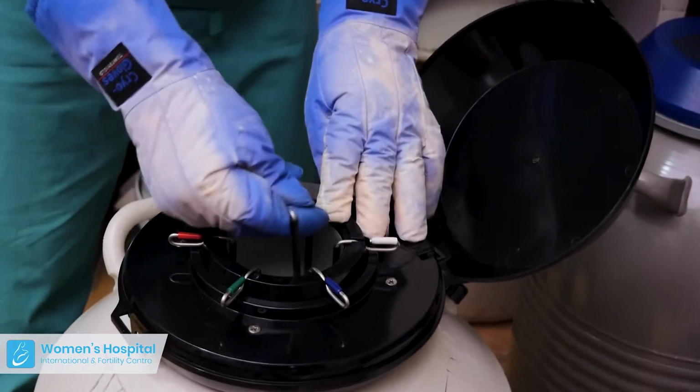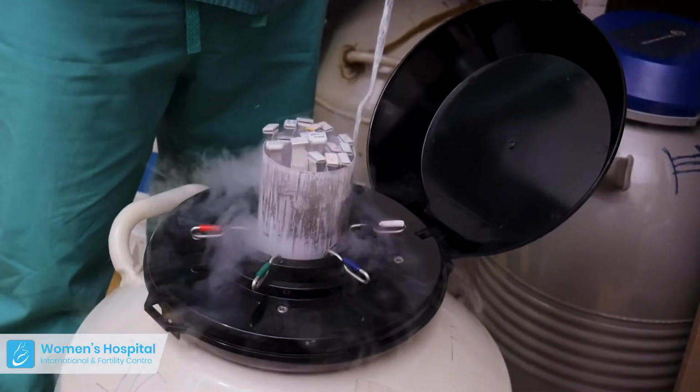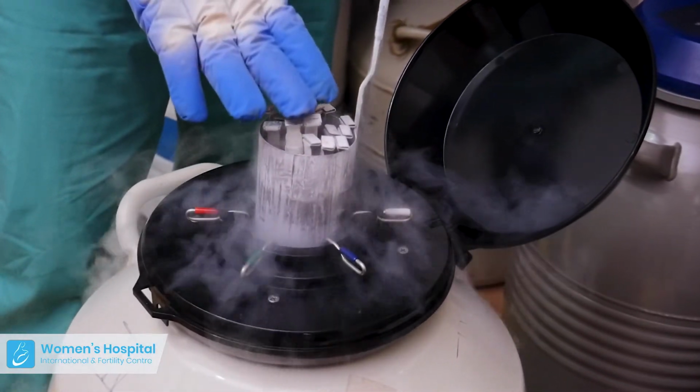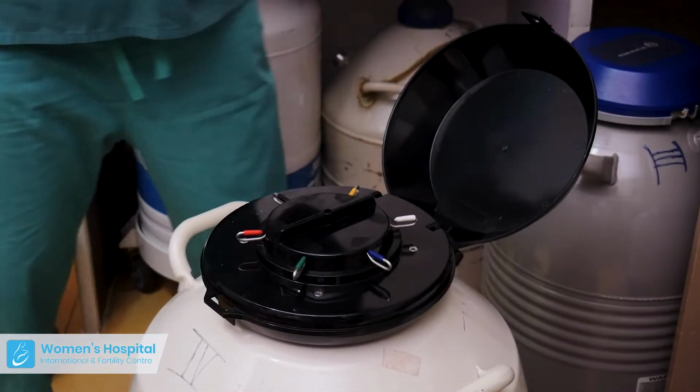We keep our sperm in small vials. They call them cryo vials. These are specifically designed to withstand very cold temperatures. The sperm are frozen in solutions. We call them cryoprotection solutions. Cryoprotection solutions mean that the sperm are safe even at a very low temperature. These solutions cover the sperm. They form a kind of coat around the sperm cell. So even if the sperm experiences very low temperatures, they do not affect the integrity of the sperm cell, and it can still be removed and used at a later date or a later time when the need for it arises.